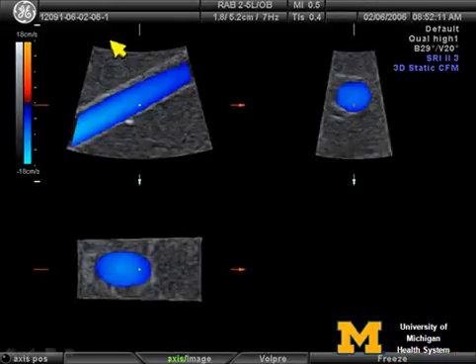However, when you swing the array across, you get other planes. So if you're swinging the array across the tube in the axial elevational direction, you get this. This would be equivalent to rotating the probe 90 degrees. So this would be a very standard picture, and this doesn't provide the information you want.